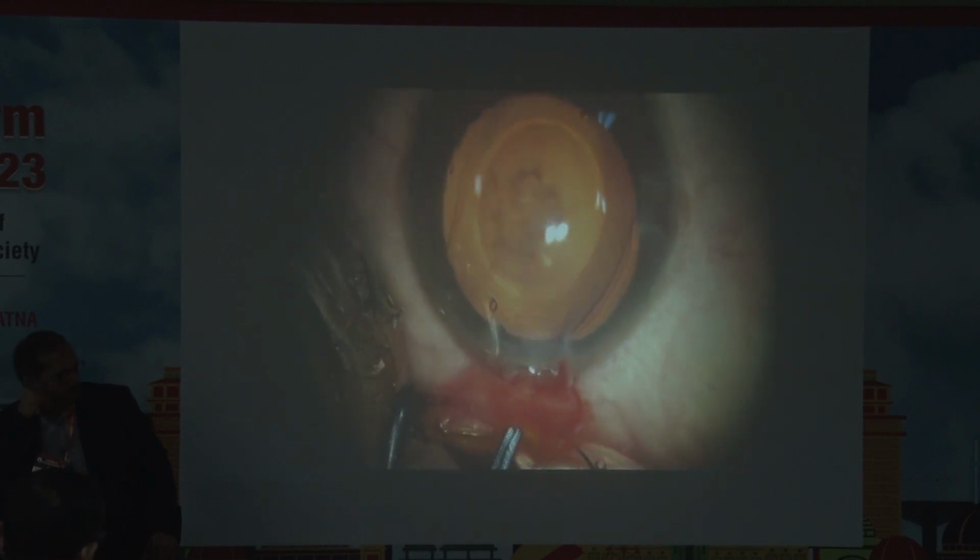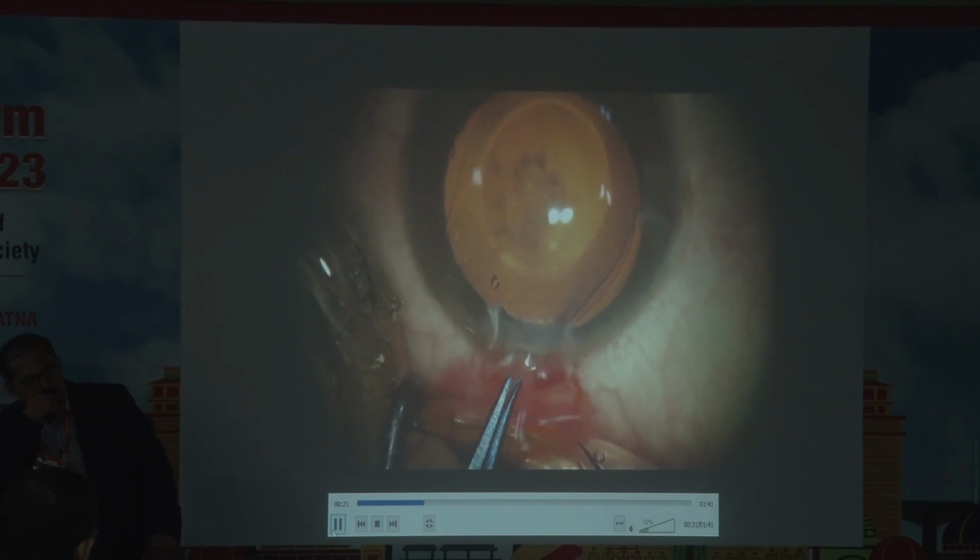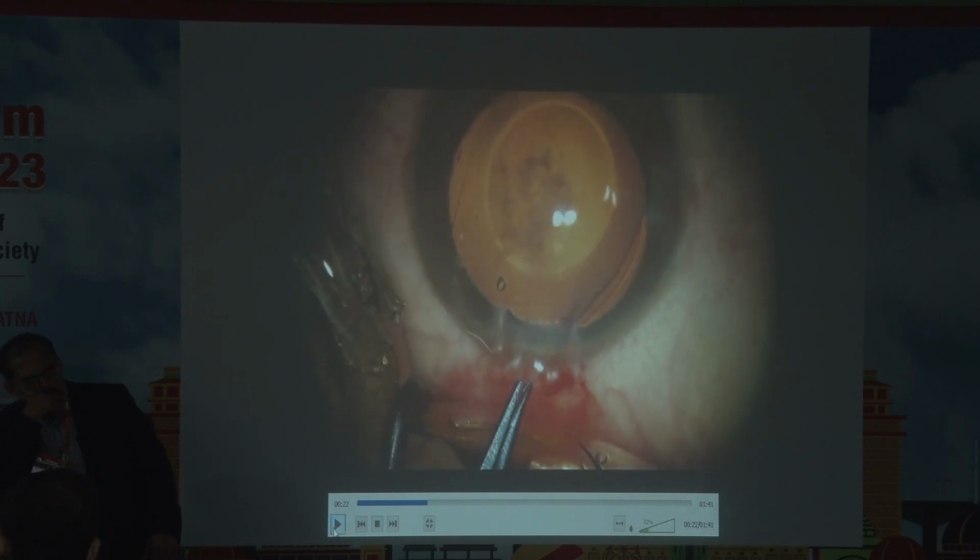In fact, the patient came to us in 2.5 days, and we were also not very sure what to do. We tried to constrict and so on. Like I said, this is about an 11-year-old video. I was also not that smart at that time. So we waited for another week before we actually thought of implanting, because the patient was minus 11. The other eye was already phakic. Pachymetry was 460. So we were also trying to debate what to do, whether this will go away.